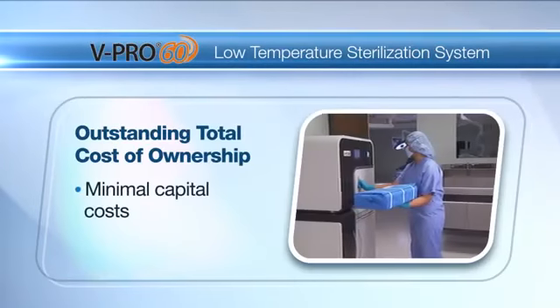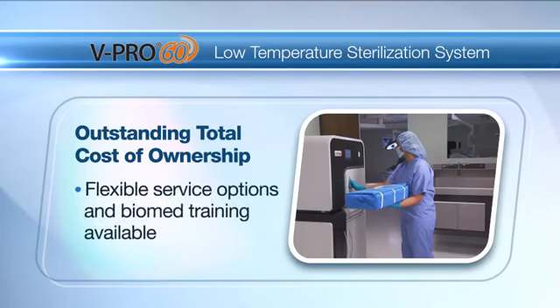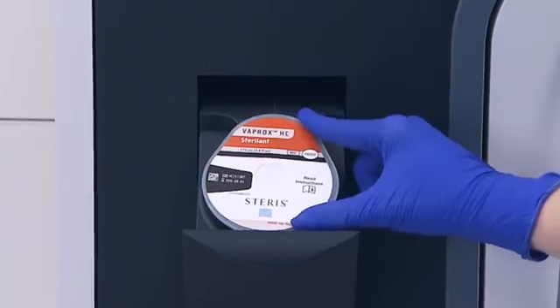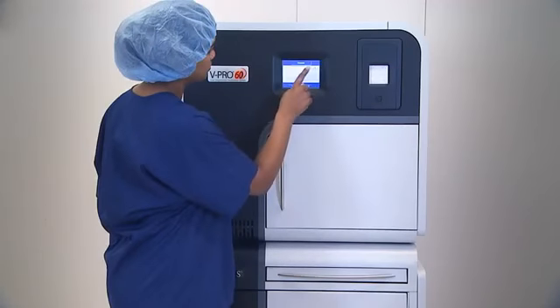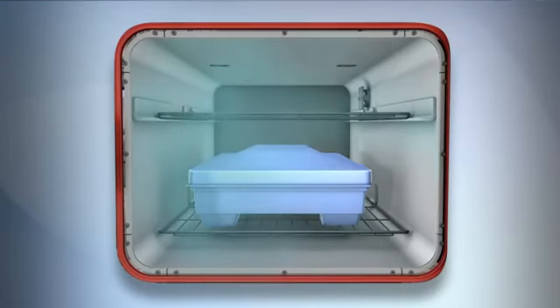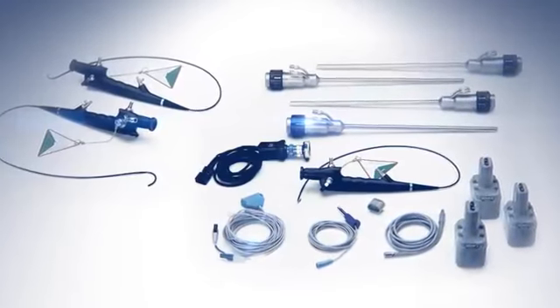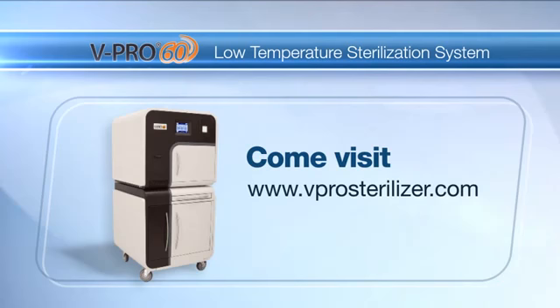A small footprint packed with value, this cost-effective, low-temperature sterilization solution will help you get the job done while minimizing your total cost of ownership over the equipment life. In addition, the vPro60 Sterilizer uses 59% hydrogen peroxide throughout the entire cycle. This simplifies the process and is better for material compatibility with devices. Lower concentrations of hydrogen peroxide means less wear on adhesives and surfaces of devices, which could reduce repairs and repair costs.